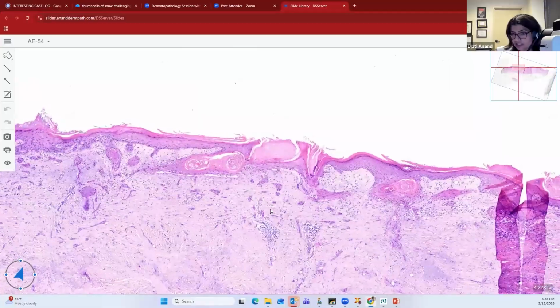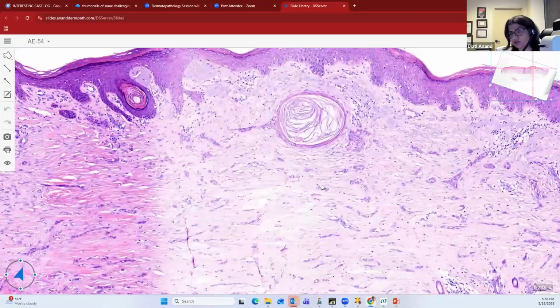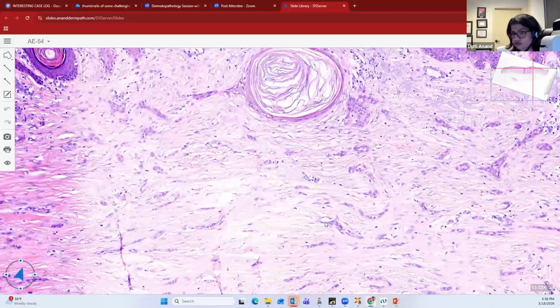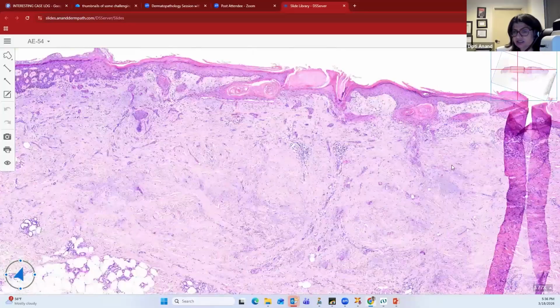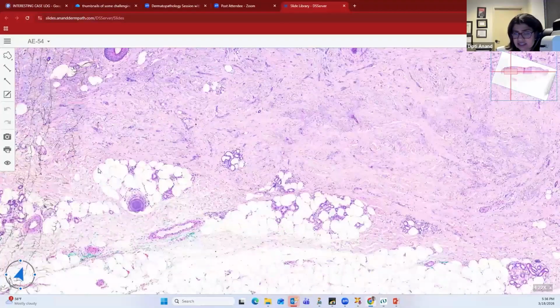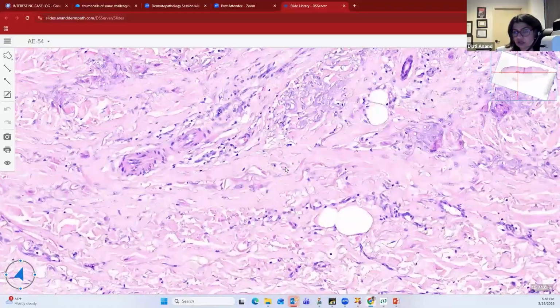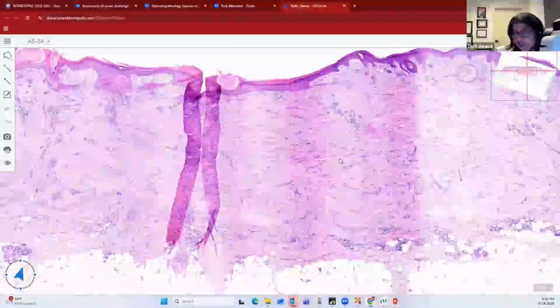The top portion of the lesion will basically have horn cysts, like a desmoplastic trichoepithelioma. So you can see the nice horn cysts, and again the infiltrating nests and cords of islands. But honestly, what makes it malignant is the infiltration. So you can see that it's extensively going into the deep dermis and the fat. You often see perineural invasion within the tumor, which is a clue that you're dealing with a malignancy.